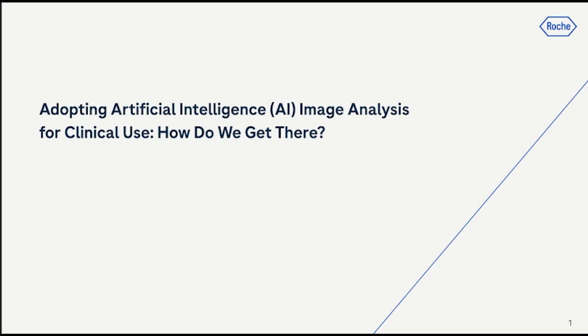And that's where slide quality really almost factors into performance evaluation of that AI, meaning at what point does the performance of that AI actually drop below a certain level of slide quality? And I think that's something that really is uncharted territory, in my opinion, but really needs to be further investigated.